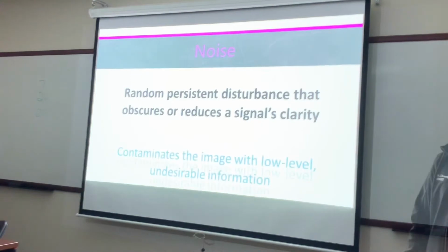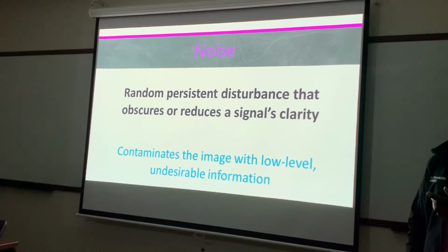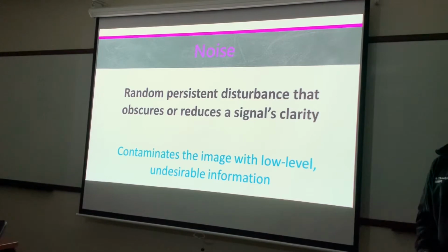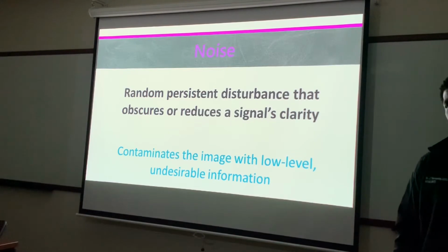And in sagittal, say you're looking at the mid to distal aorta, right above the umbilicus. When you're looking at the mid aorta, because it's a lot deeper, it may have a lot of noise associated. Remember, you can't always get it super clean. It's a blood vessel, it has fluid in it, so it should be black. It shouldn't have anything in it. But sometimes you can't get it cleared up, and it'll have those hazy looking lines in it. That's what we're talking about. We're talking about noise: those low level echoes that give us undesirable, unwanted information.